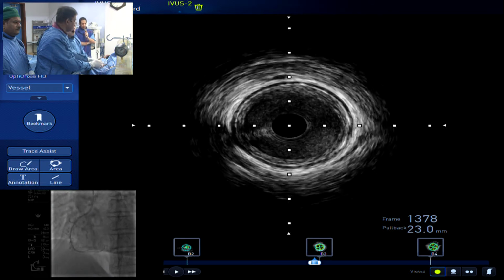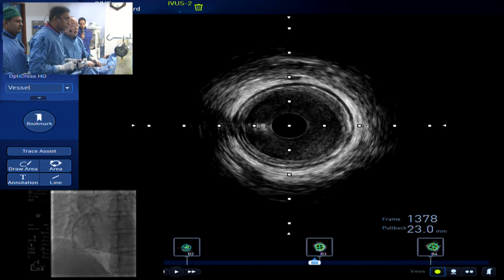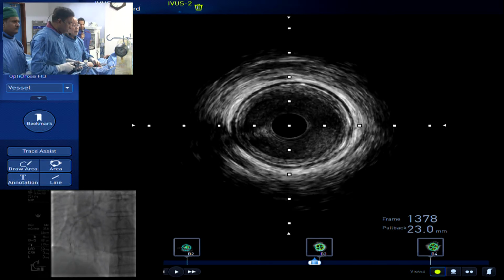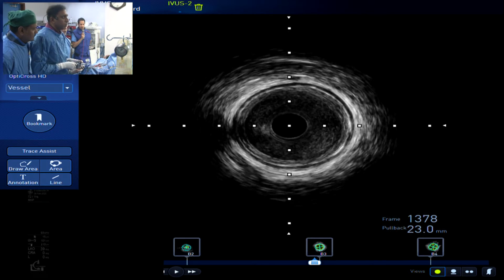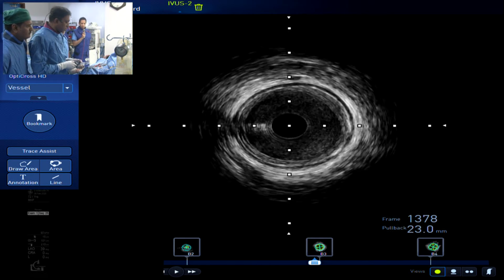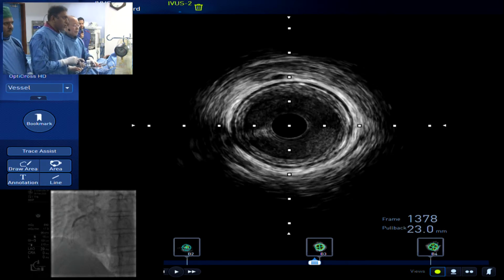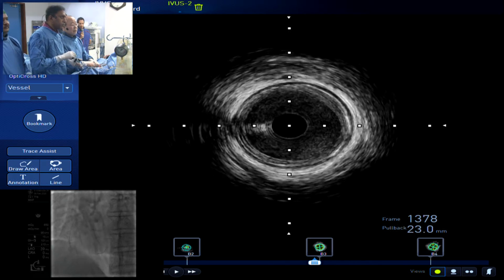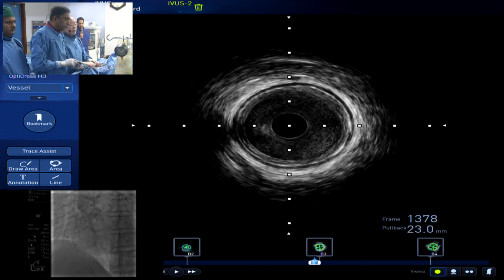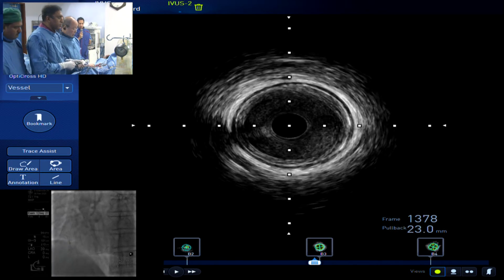Yeah, in the very straightforward case, here with IVUS, you're through all the way. I think this would be one case where, if everything went well, I'd be comfortable going same day. But I agree, while we really moved across to same day dismissal, the CTOs we've typically kept overnight for the usual reasons: bilateral access, delayed perforation, as you're saying, maybe other elevated risks too. Maybe that will change over time. But my comfort level is still, if in any doubt, with a CTO, to keep them overnight.